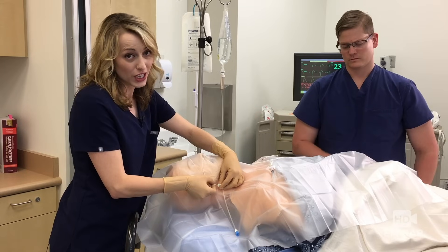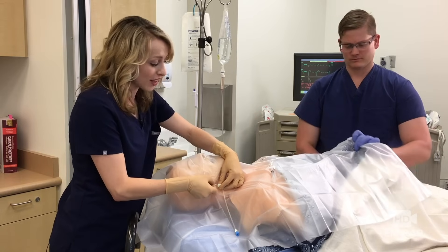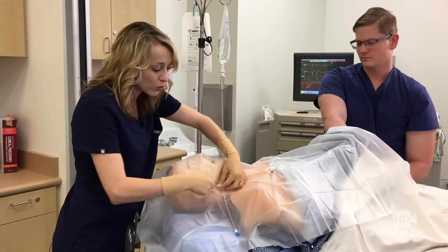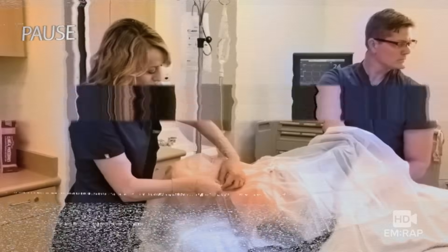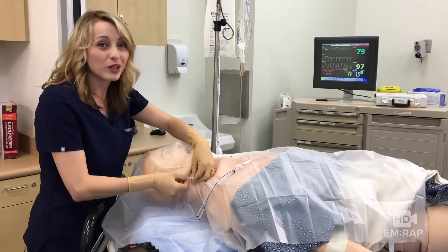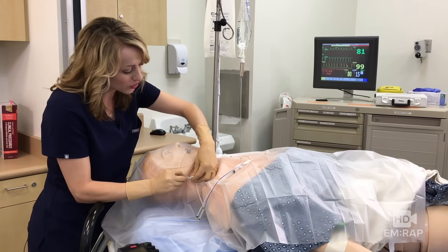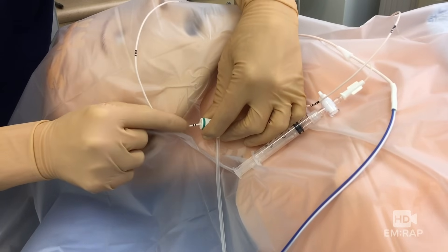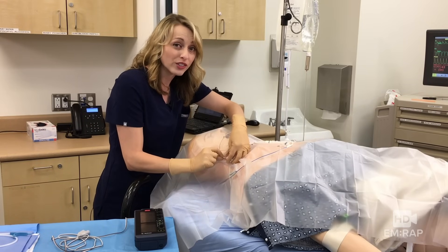If you have an ultrasound machine and a skilled sonographer, recruit help and get a sub-xiphoid view so you can watch the wire going into the RV. If you don't have ultrasound, no big deal — you can do this by watching the cardiac monitor and looking for an injury pattern, which we'll show in just a second. Continue inserting the wire until you get to the 20 centimeter mark, indicated by the two black lines on the wire. At that point, the tip of your wire and the balloon are just outside the cordis sheath.